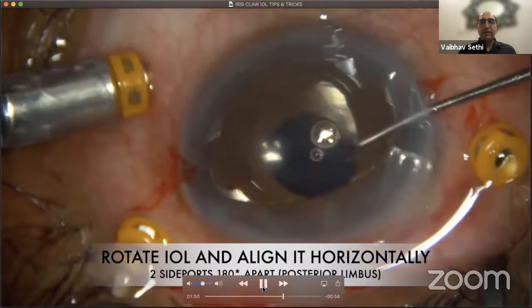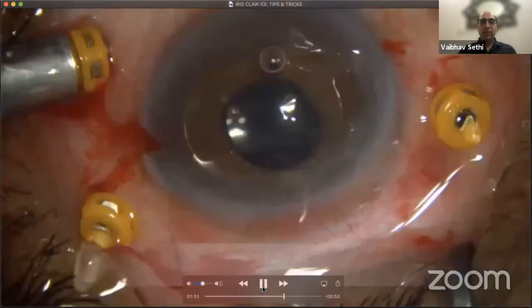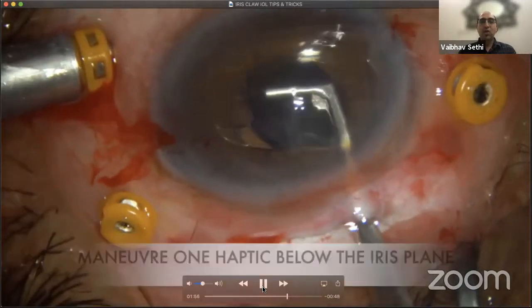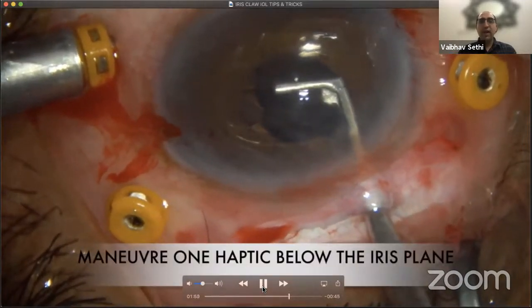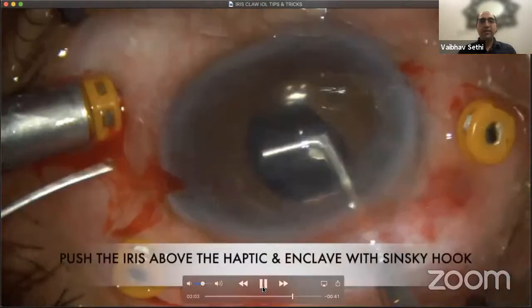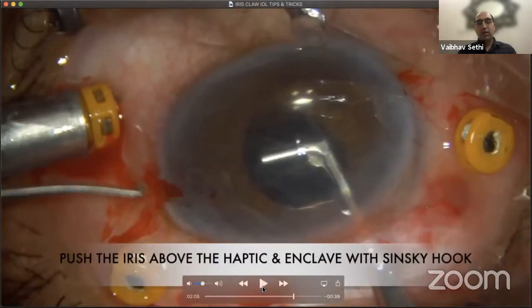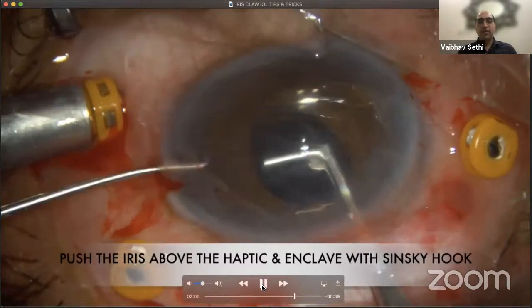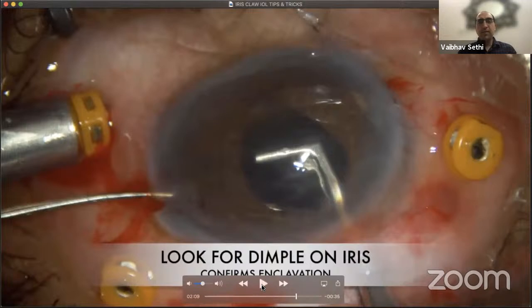Now after placing it in the AC, rotate it so that it's exactly in the position of the side ports. Now go inside, hold the iris claw lens and maneuver one of the haptics below the iris plane, and slightly, gently, with the other hand, you can place your spatula or the side port instrument before you do this procedure. That can sometimes help you. After that, slightly lift up the iris tissue wherever the clip is.